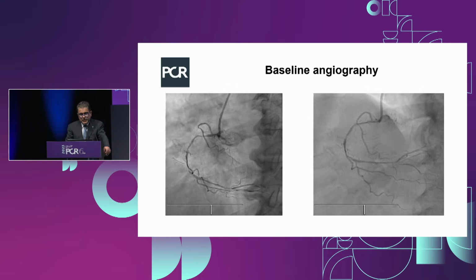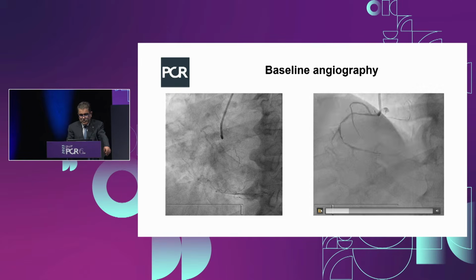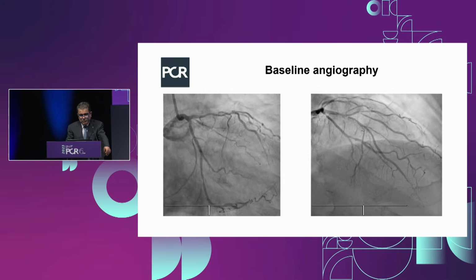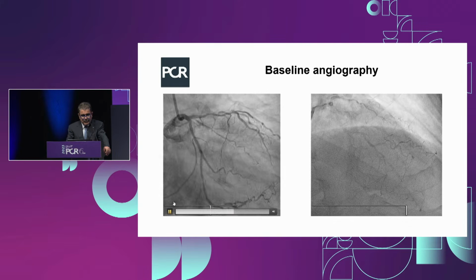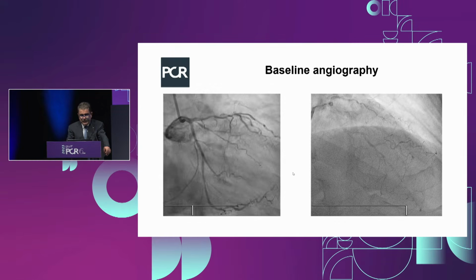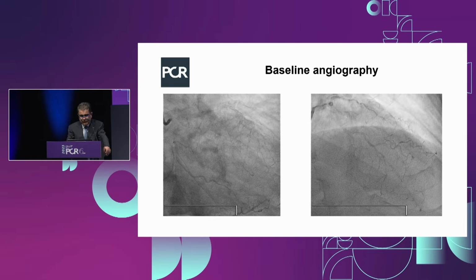So that's the baseline angiogram that was sent to us, and let me run it again. So the right coronary showed multiple lesions, long, smallish vessel. And as we will learn through this session, you can appreciate significant lesion in the LAD and maybe in the circumflex artery, but the LAD looks calcified, long, and involving, I believe, the large diagonal, which itself has disease as well.